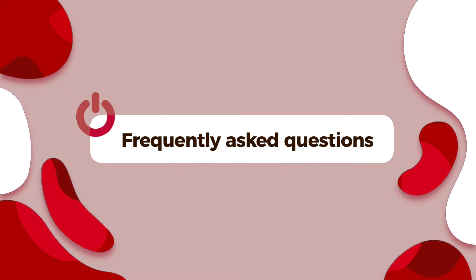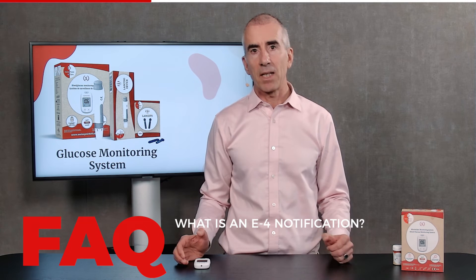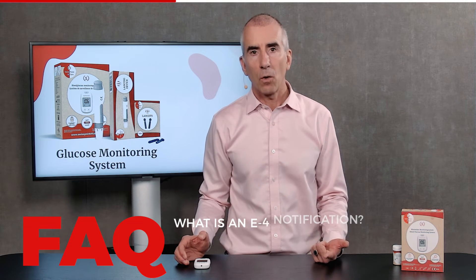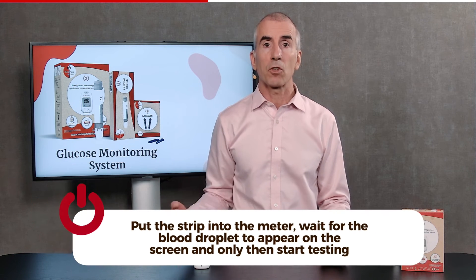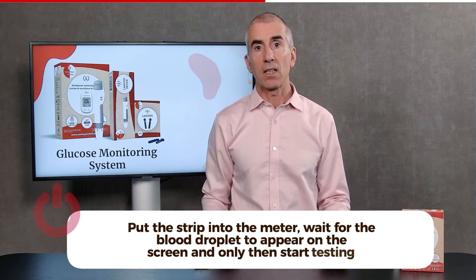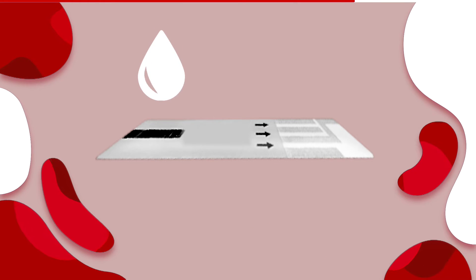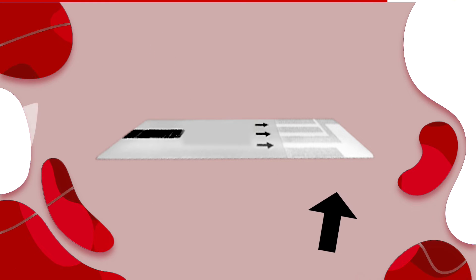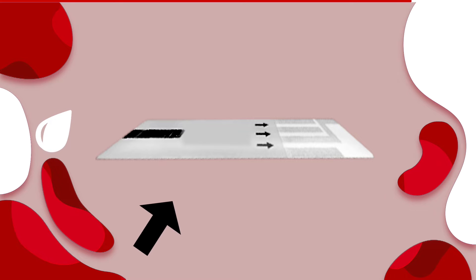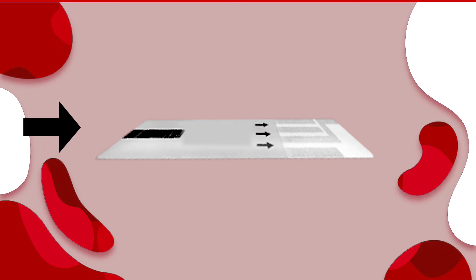Let me answer the frequently asked questions. Error E4 — there are a few reasons this can happen. It means either the strip has already been used, or you have too little blood. Make sure that you first put the strip into the meter, wait for the blood droplet to start blinking, and then take the blood from your finger. A second reason can be that you put the blood on the wrong place of the strip. There is the flat end of the strip — if you put it on the white part, nothing happens and it might generate an E4. Remember that the blood needs to go into that side, so with your finger and the blood droplet you touch with the end.